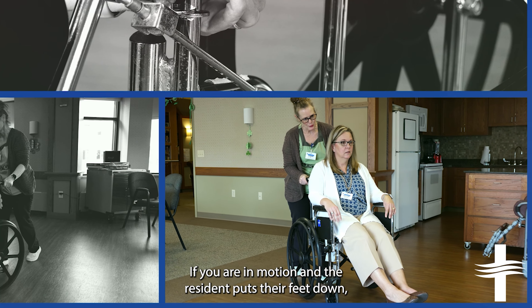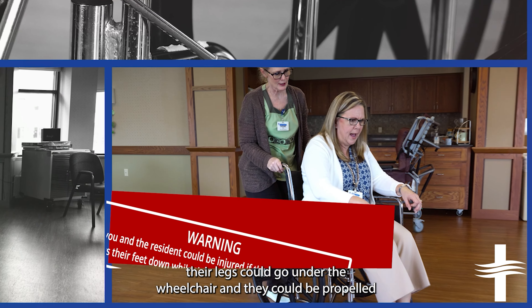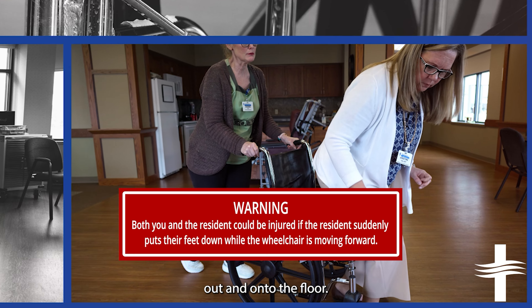If you are in motion and the resident puts their feet down, their legs could go under the wheelchair and they could be propelled out and onto the floor.